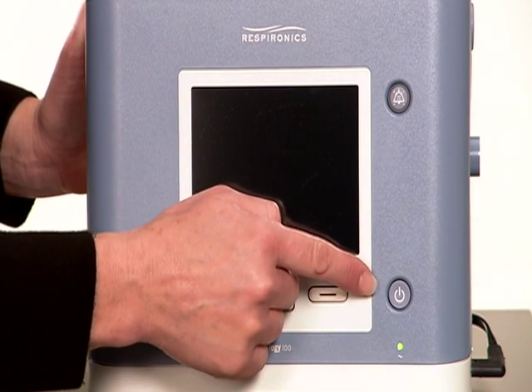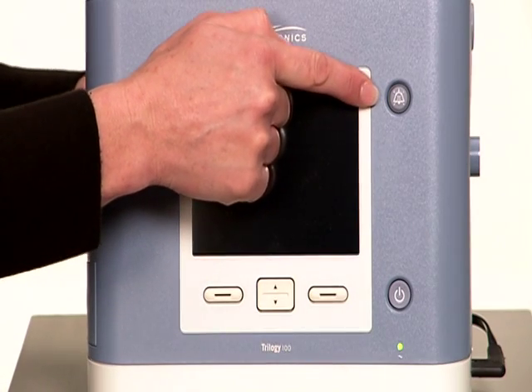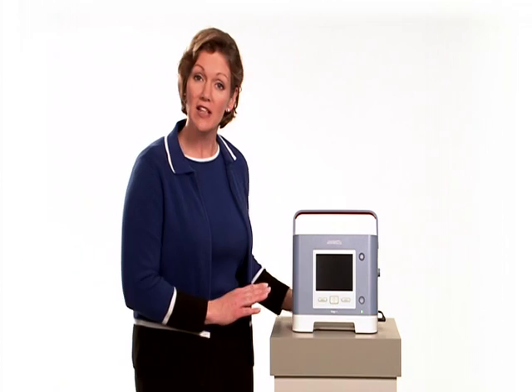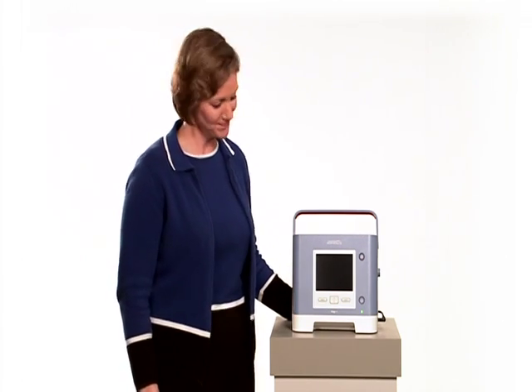The Start-Stop button at the bottom starts and stops the flow of air, which is how you begin or end therapy. Above it is an audio pause button, which temporarily silences the audio portion of an alarm. If the cause of the alarm is not corrected, it will sound again in 1 minute.